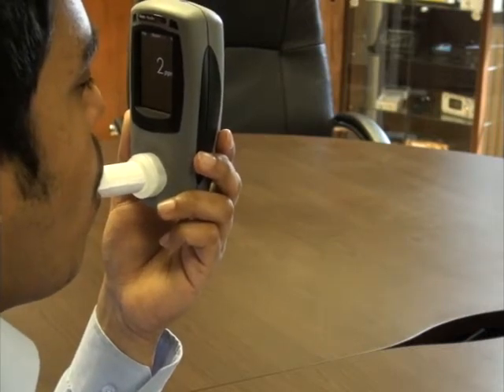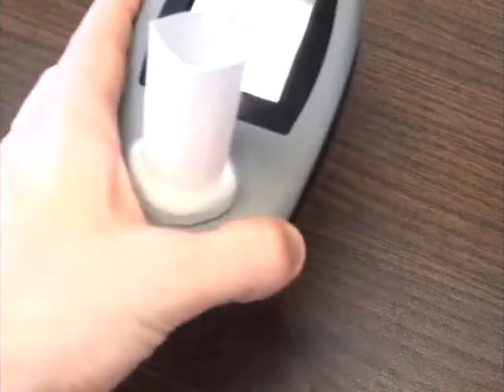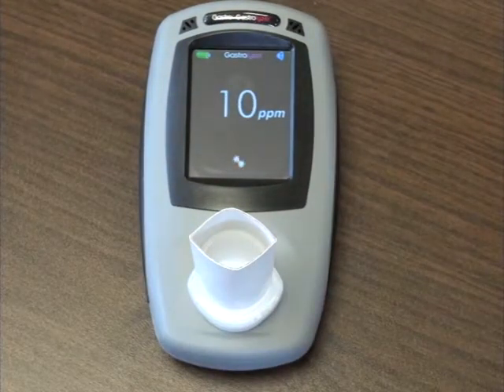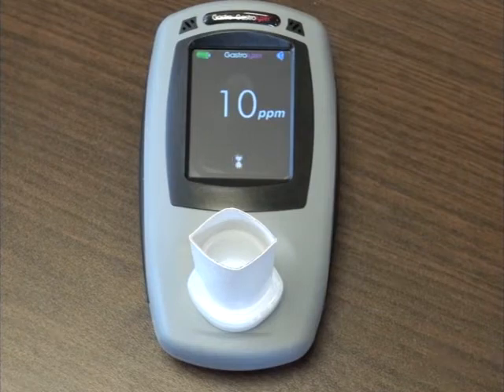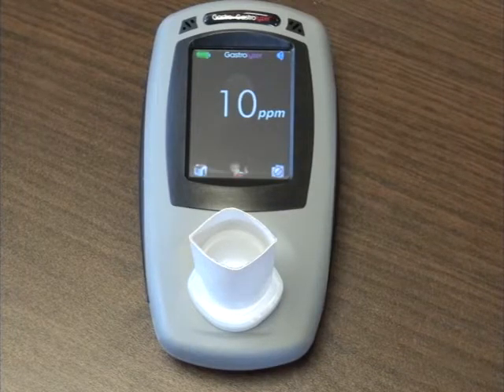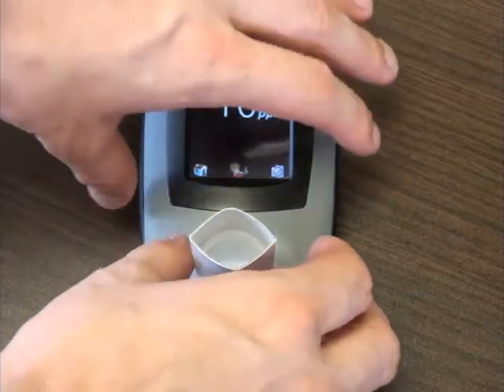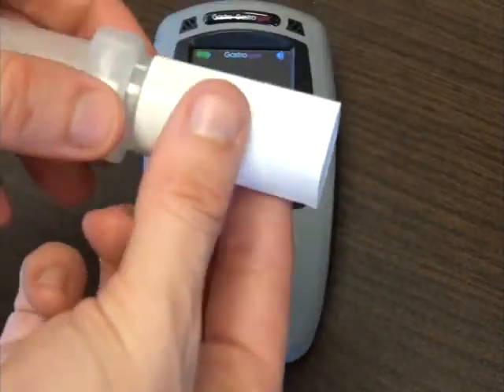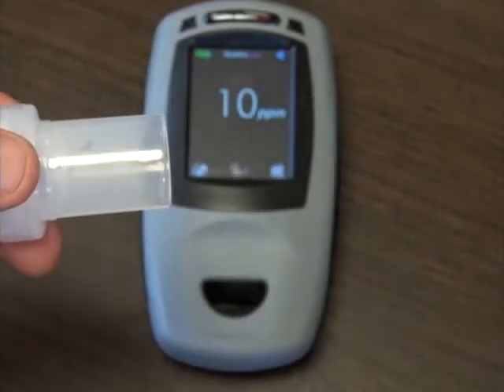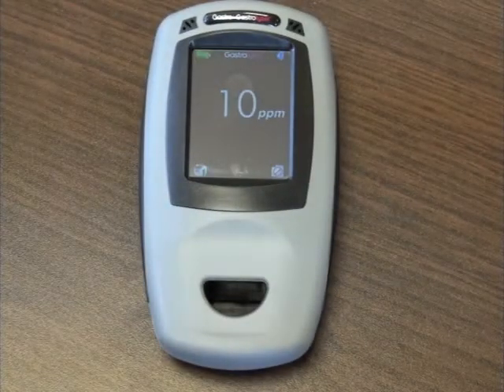As seen here, the display will show a rising ppm value. The peak reading will be shown on the display. The test is complete when the icons shown here are displayed. Please remove and discard the flat-pack mouthpiece or face mask safely, as these are single-use only consumables. It is advised to remove the device between tests to allow fresh air to circulate around the unit.